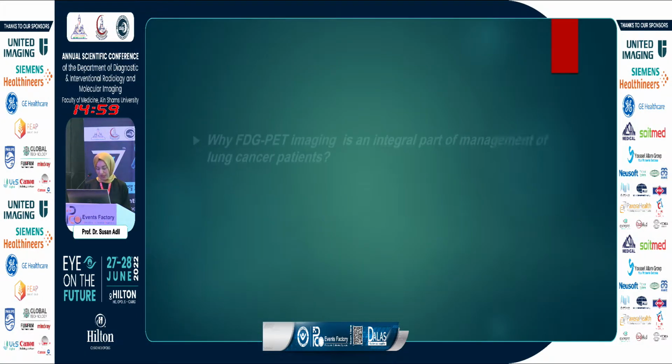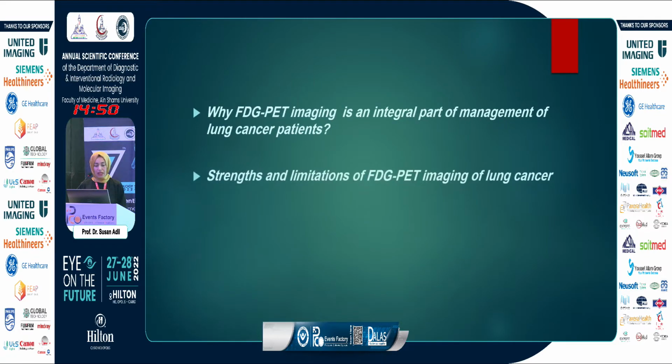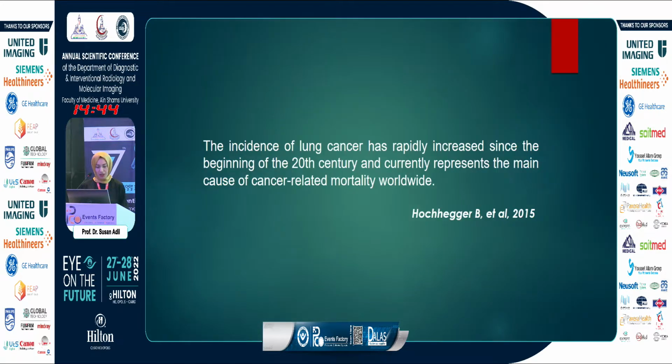The aim of this talk is to know why FDG PET imaging is an integral part in management of lung cancer patients, knowing its strengths and limitations, and recent advances in PET imaging.